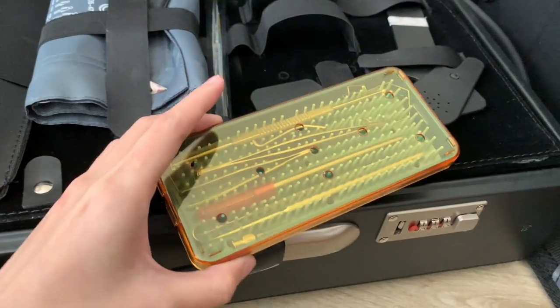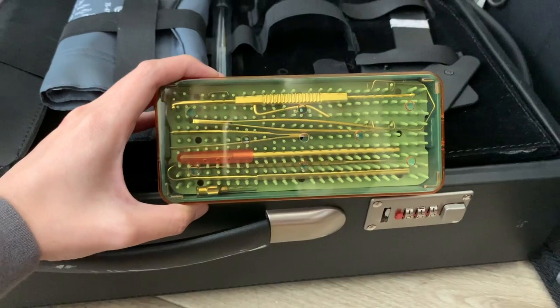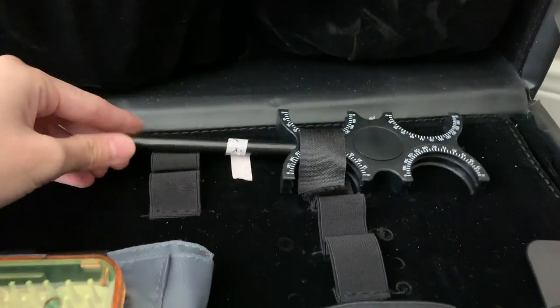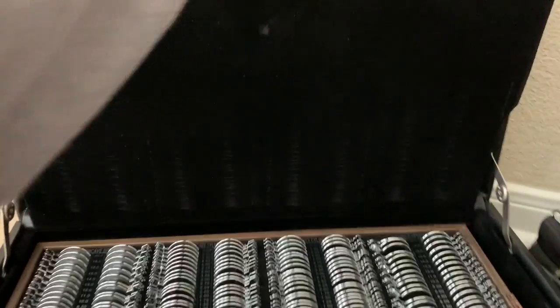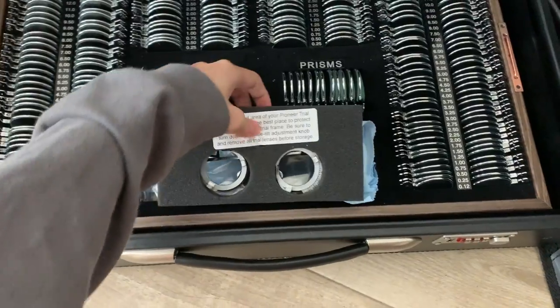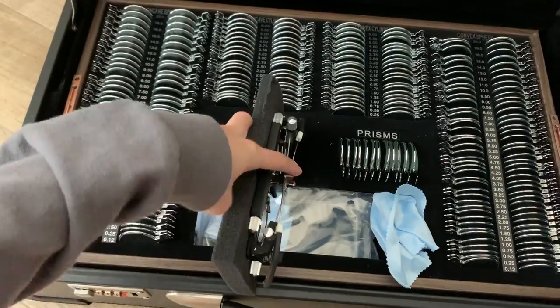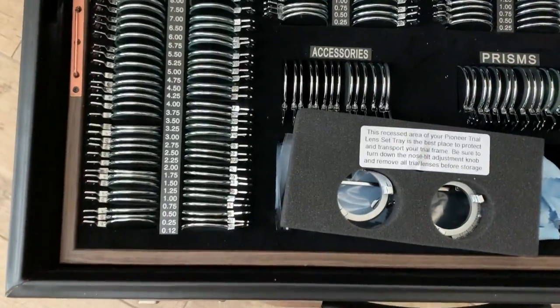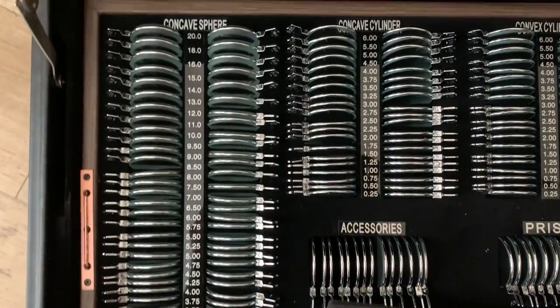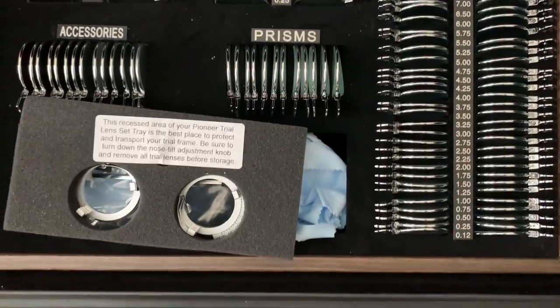Here's the foreign body removal kit. Here's the loose lens holder and the pinhole. Here are the lenses and this is the lens holder — you put the loose lens in so the patient can wear them.